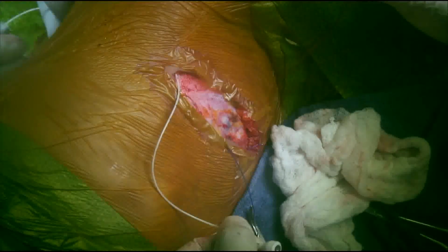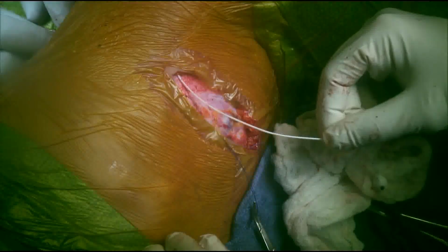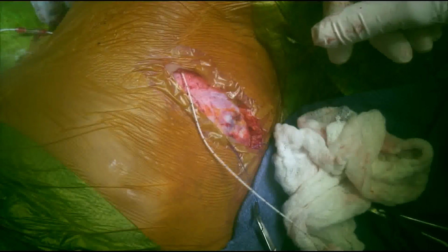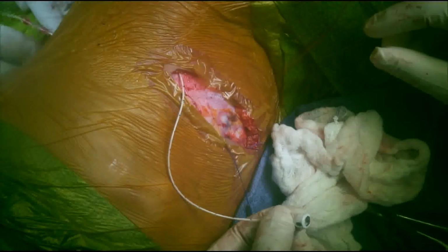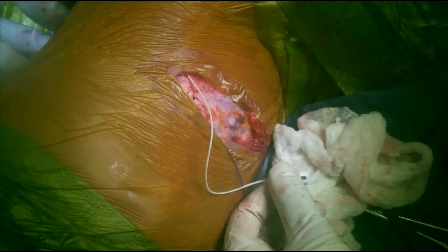This can sometimes take a few minutes until the CSF backflow reaches the abdominal side. Observing the backflow also ensures that the catheters are properly connected and that the intrathecal baclofen medication will pass through the catheter without any leakage or any problems.